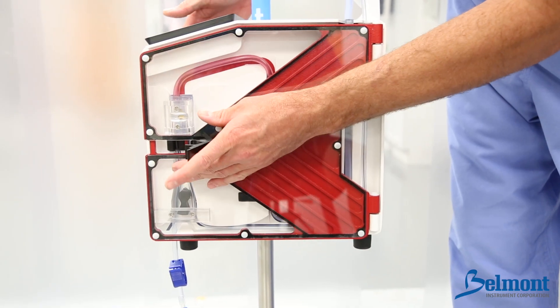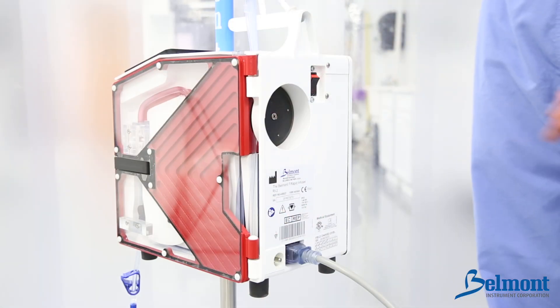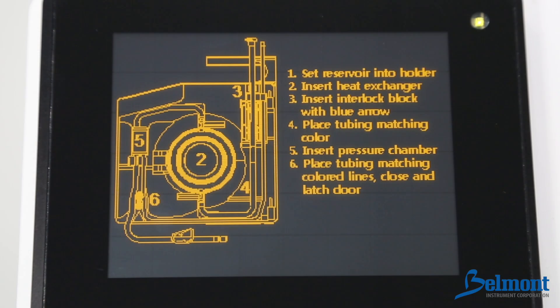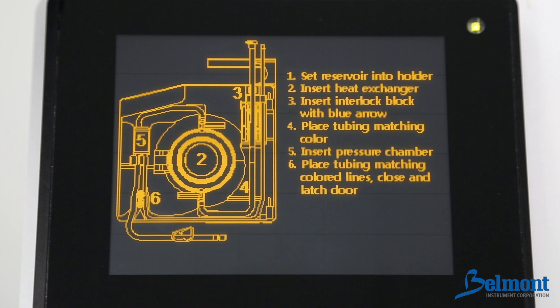Finally, close and latch the door, making certain the pump tubing is not caught. You are ready to power on the system. Press the power button firmly to the on position, which is located on the back of the device. After a brief self-test, operation instructions will be displayed on the screen. When first switched on, the screen will display instructions for installing the disposable set.